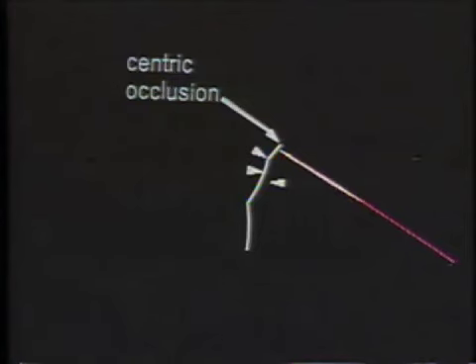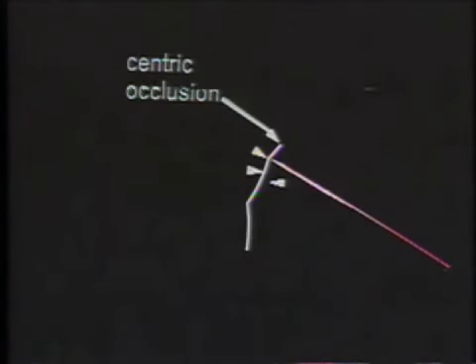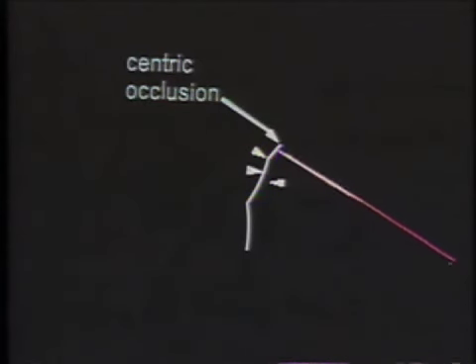The contact generally at centric relation is on inclines, so if the patient closes in centric relation and squeezes, they slide into centric occlusion, which is a maximum interdigitation of the teeth. So we have a slide in centric into centric occlusion. This terminal hinge movement can be used in transferring a set of study casts from the patient to the articulator, provided we locate or determine this terminal hinge movement.